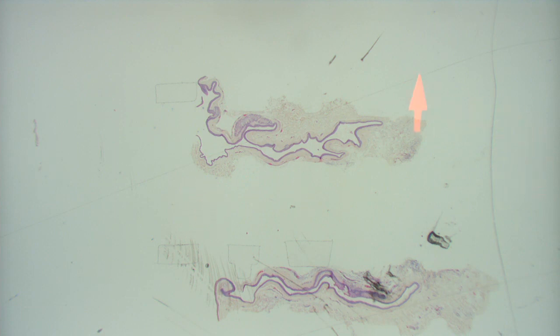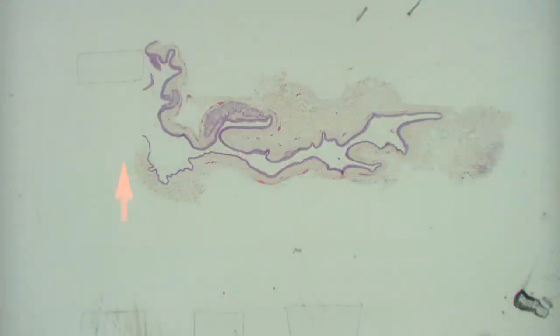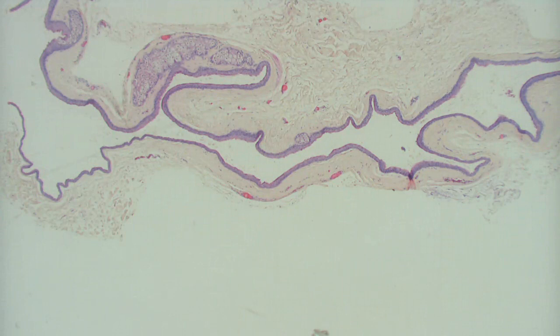So there's no epidermis here, so maybe this just popped out. Okay, so what are we looking at here? Well, a cyst of some sort. Good, a cyst. Once you've got into the category of cyst, then you have to say, what kind of cyst is it? How do we diagnose cysts? How do we name cysts? Just by the lining. Yeah, by the lining. Excellent. So what is the diagnosis of this cyst?